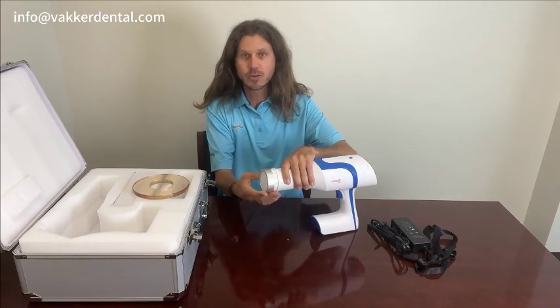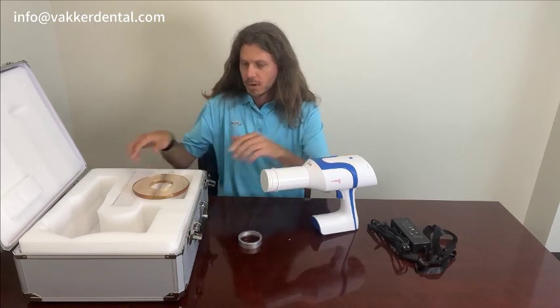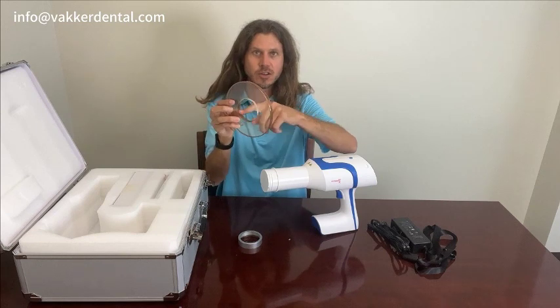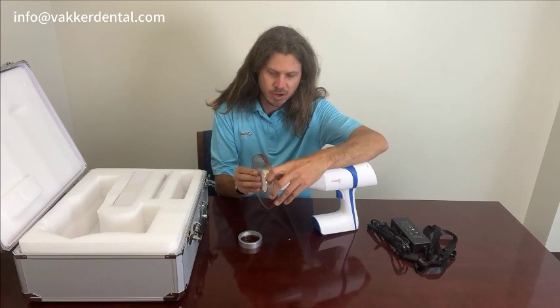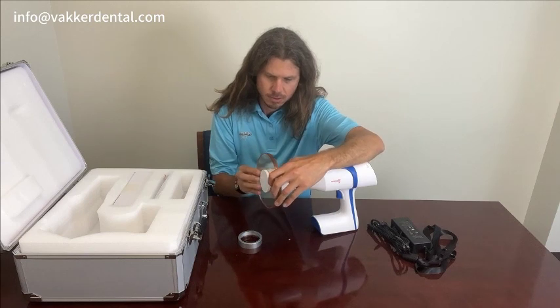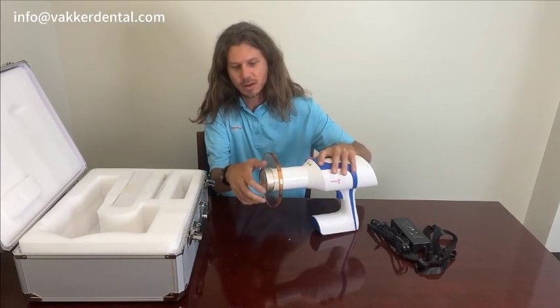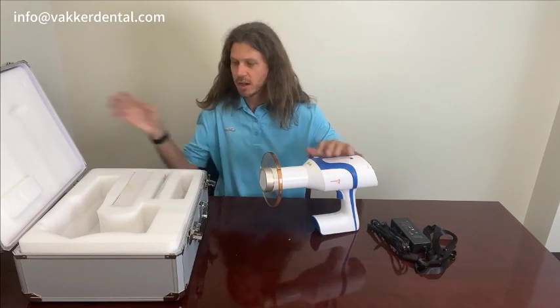You're going to go ahead and unscrew the silver part on the gun. You're going to take your scatter shield — you're going to see there are some lines right in here. You're going to go ahead and line them up right here, and then you're going to lightly press it on. It goes on fairly easy. You will want to be careful — it is kind of fragile. Then you'll put your silver piece on and screw it on, nice and tight.